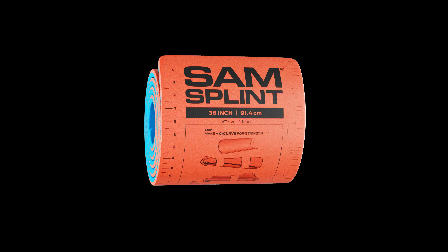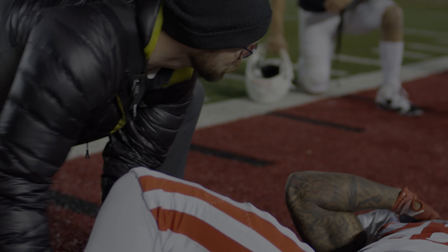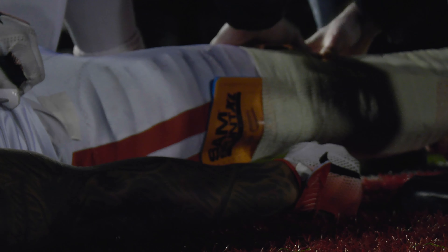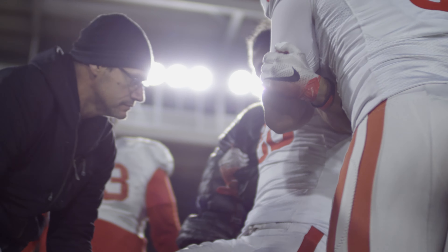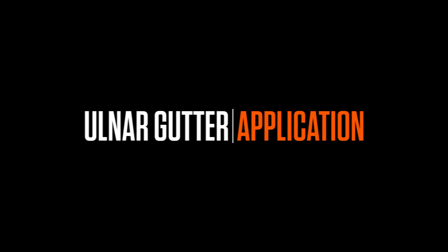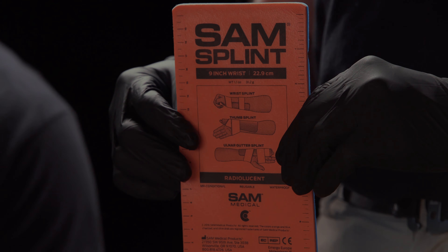This is Sam Splint by Sam Medical. Select the appropriate size of Sam Splint according to the size of the patient's arm and wrist.